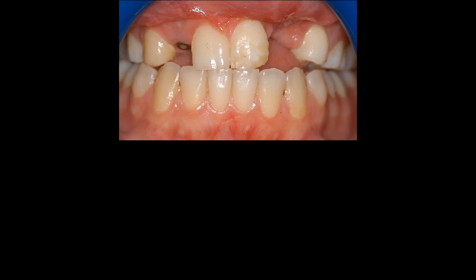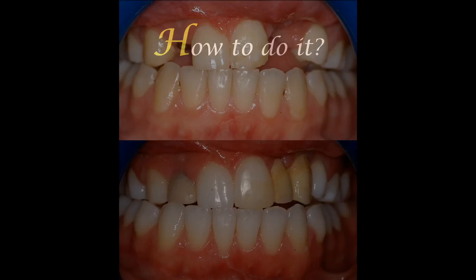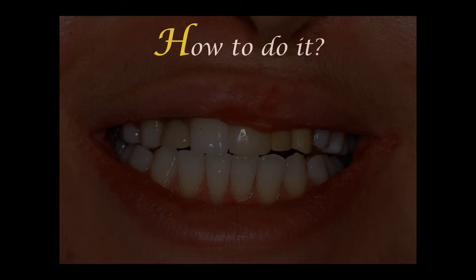No matter what we tried to do to bring this premolar into occlusion, the premolar would rebound apically. When discussed with the orthodontist, the position of the central incisor also could not be kept in its proper position. This is at the temporary stage after ortho treatment. So what to do?